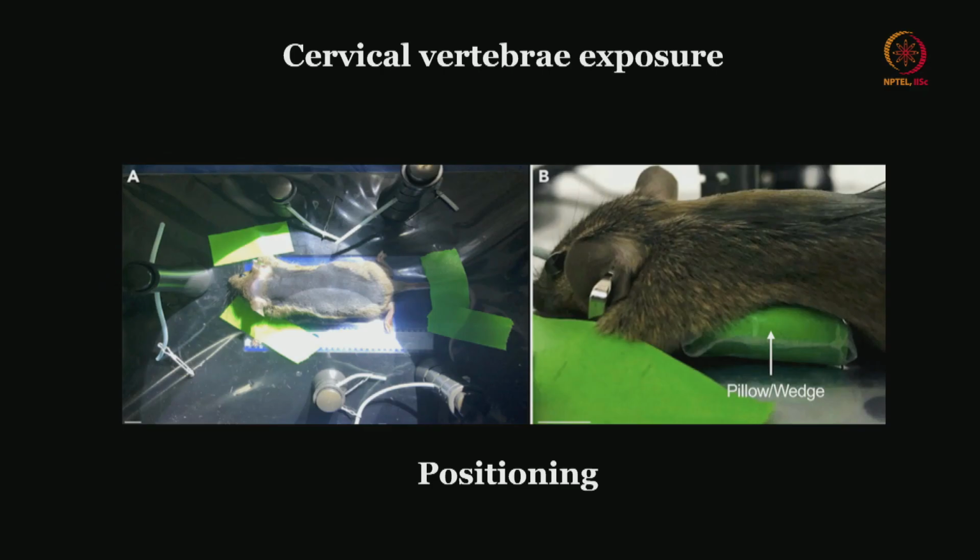Alright. So the remaining part of the presentation is about the cervical vertebrae exposure. Again here, for spinal surgery the positioning is entirely different. You need to make sure the area of importance, or the area that you need to expose, should be at a higher level. Alright.